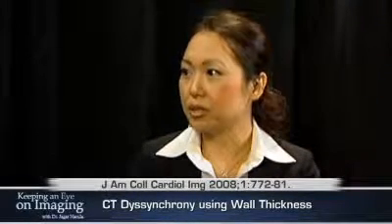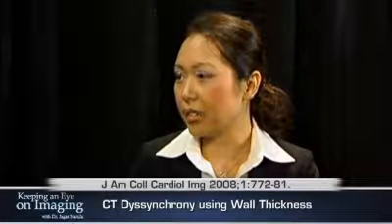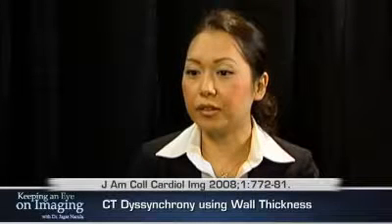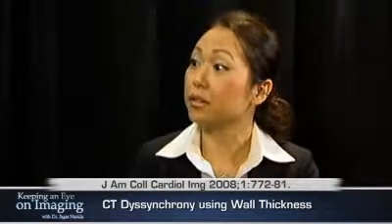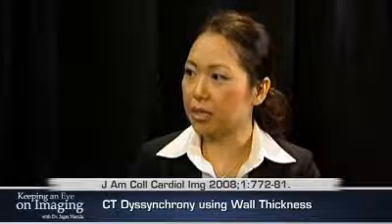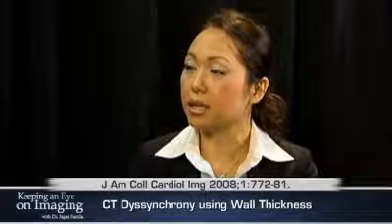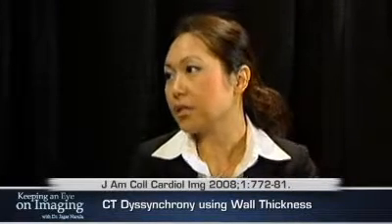The radiation issue is obviously of a concern. However, these are New York Heart Association Functional Class 3 and 4 patients, and they have 50% 5-year mortality. So they're a much higher risk patient, and their mortality rate is much higher. So the long-term consequences of cancer may be less of a concern.